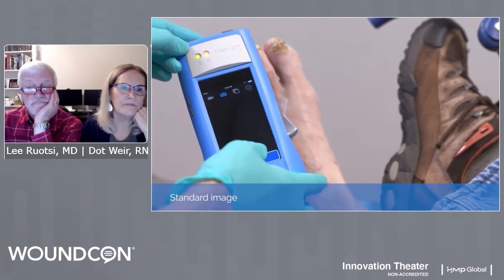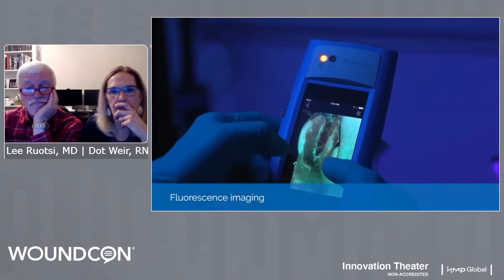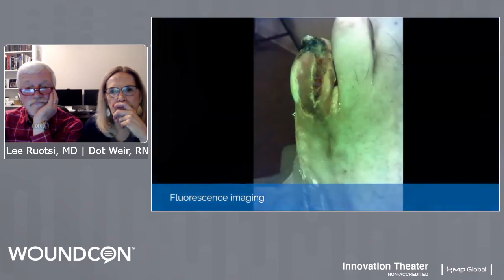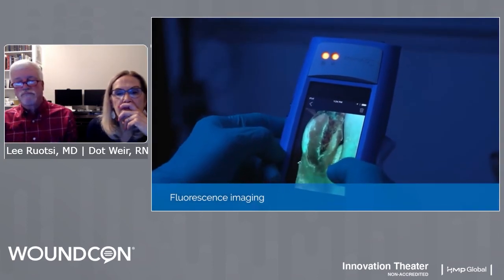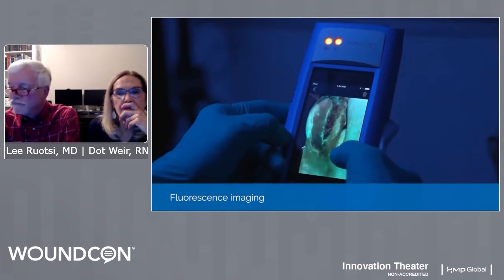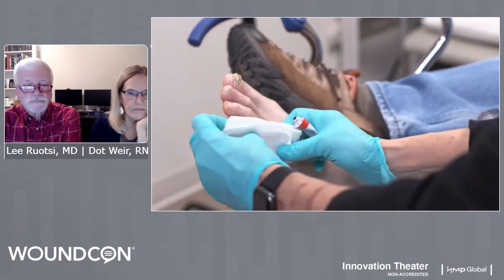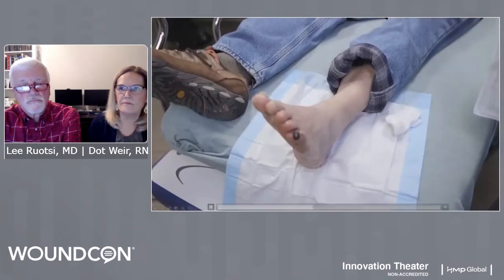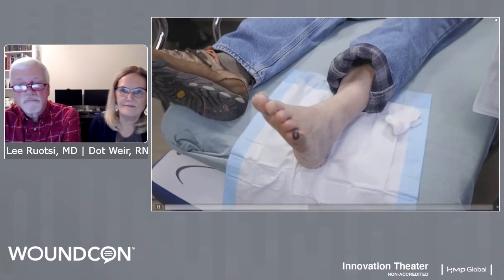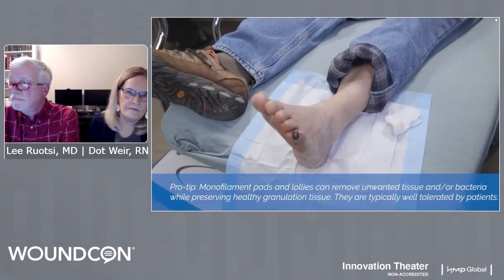We've already cleaned the wound of any debris or previous dressing residue and ointments before doing the fluorescing. When I zoom in, to the average person that might look like a little bit of clean tissue, but actually the red color is what we want to get rid of in the fluorescing — it should be dark if it's healthy tissue. I'm going to use a little lidocaine jelly for about five minutes — that's usually enough to make it tolerable. There are different ways to get a wound clean. This is a very small, narrow area, so I have the option to use a monofilament pad, which will use monofilaments to grab onto debris at the surface without pressing as hard as I would with gauze.